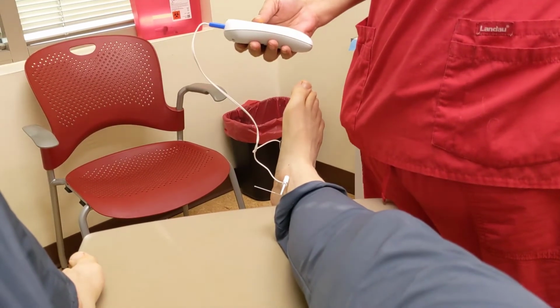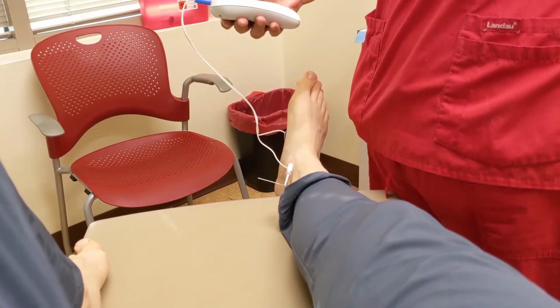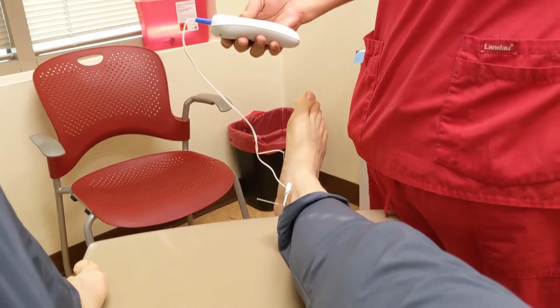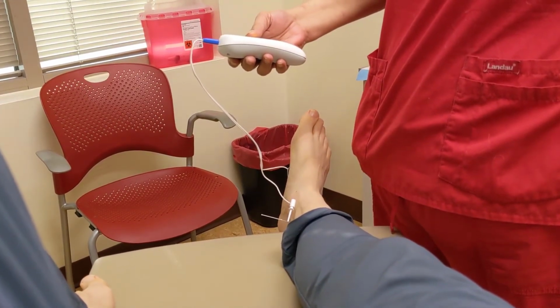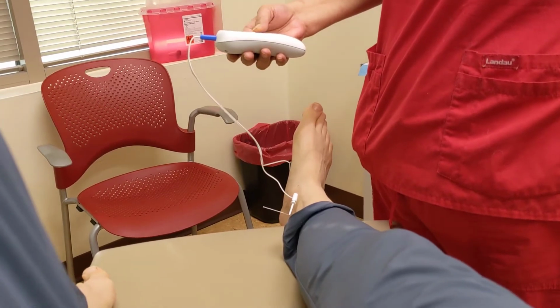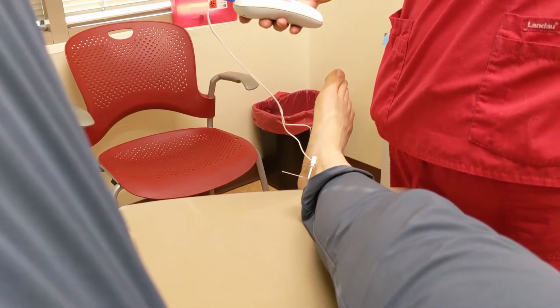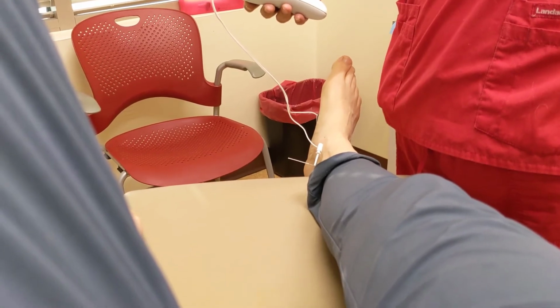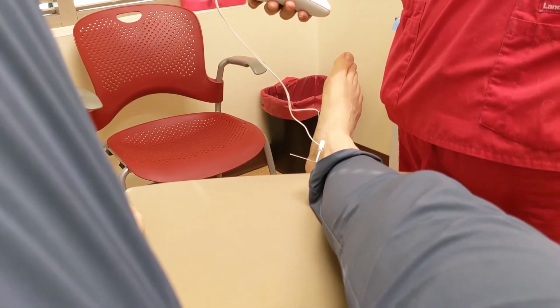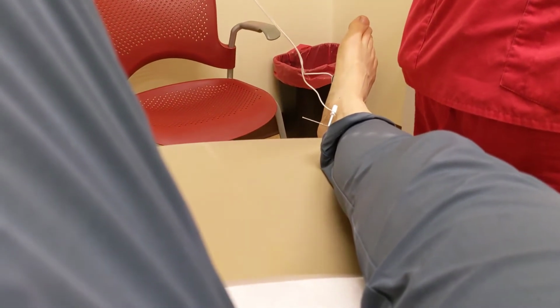Alright, so let me know when you start feeling a tingling sensation. Starting to feel a little bit. Feeling it more. Okay. I knocked it down one. Alright, so this one okay? I don't feel it a whole lot. Okay. If we go up one more, you think that would be too much? You can try it one more time. It's strong, but I think I can manage. You can handle it for 30 minutes? Yeah. Okay. Yeah, I think it's okay.